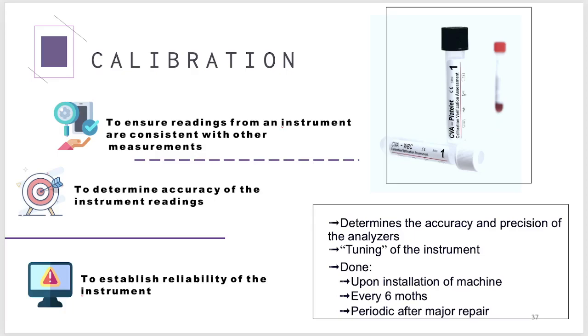Now, let's talk about your calibration. Of course, we have to calibrate our machine, no? Your QC. Of course, every morning before we run our test for that particular day, we have to do your QC, because your calibration will ensure readings from your instrument that are consistent with other measurements. It will also determine the accuracy of the instrument readings and establish the reliability of your instrument.